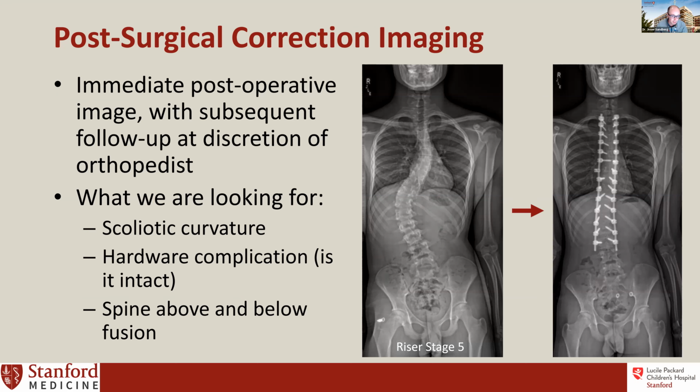We want to measure the exact same way. But for some of these musculoskeletal measurements, we want to get the most accurate measurement for that particular study. Sometimes the technique of how the x-rays are performed is slightly different. So I look at each study individually, but obviously I compare the Cobb angles on both, if that makes sense. Yeah, for sure.